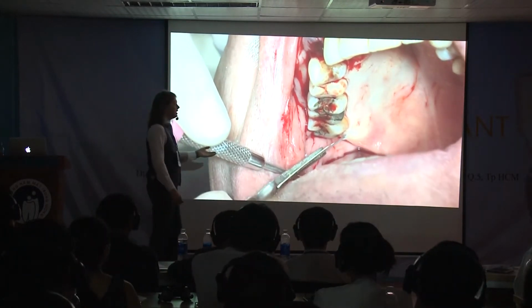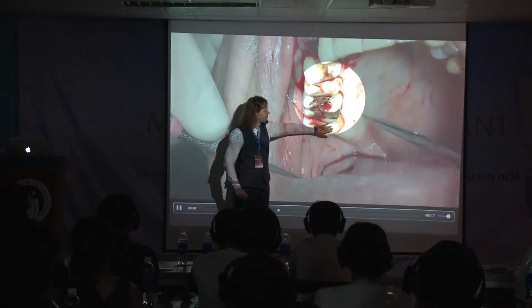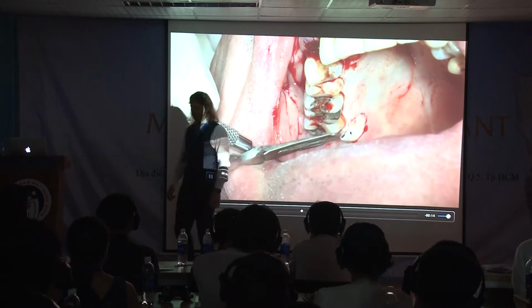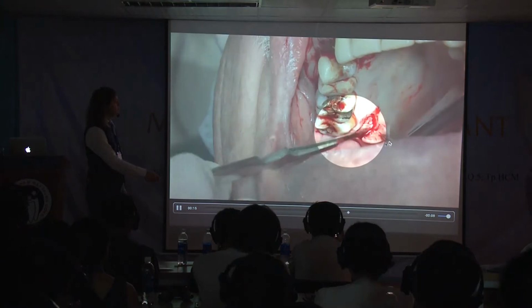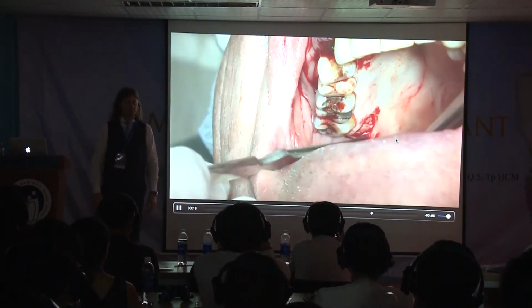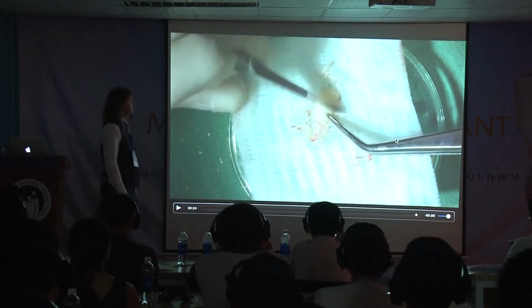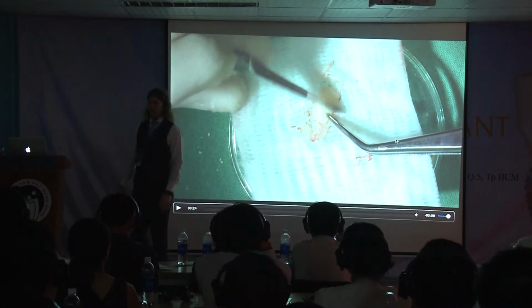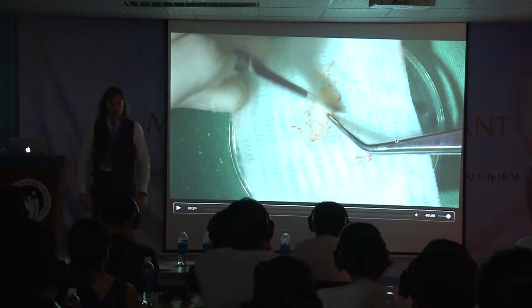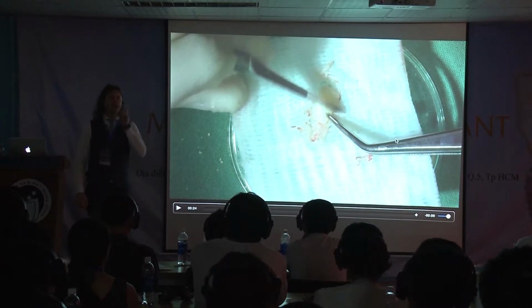Harvesting is very easy and very fast. 1.5 millimeters far from the teeth. And never, never, never cut the soft palate. It's the only rule you have. Then you deepithelialize it. Be careful, because it's very white. In the aesthetic area, you can only use bilaminar inside local tissue.